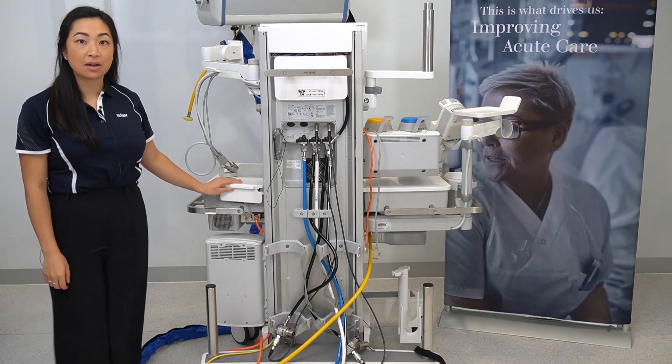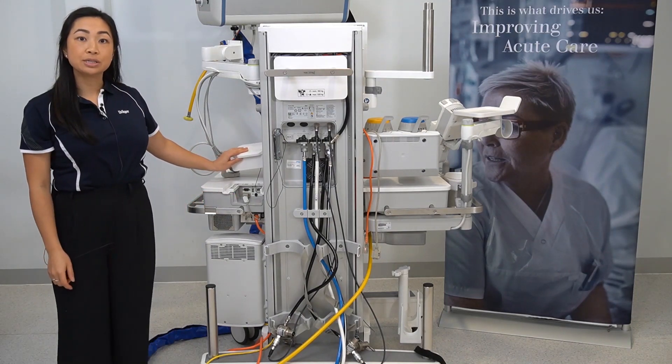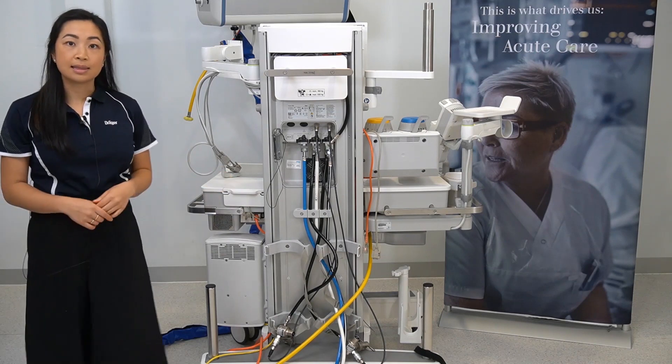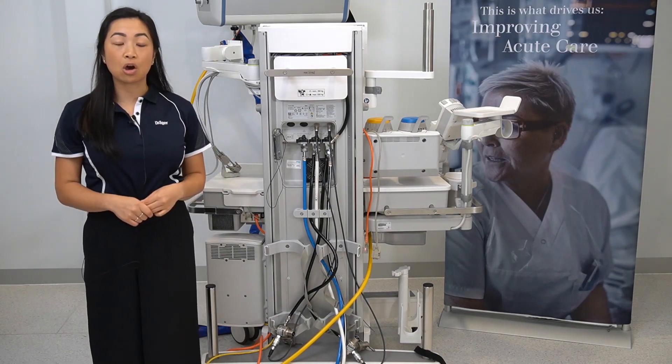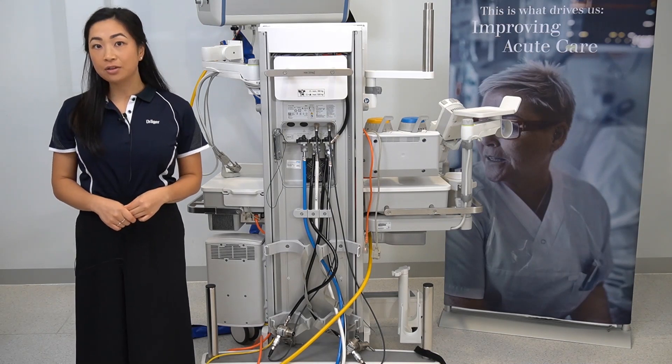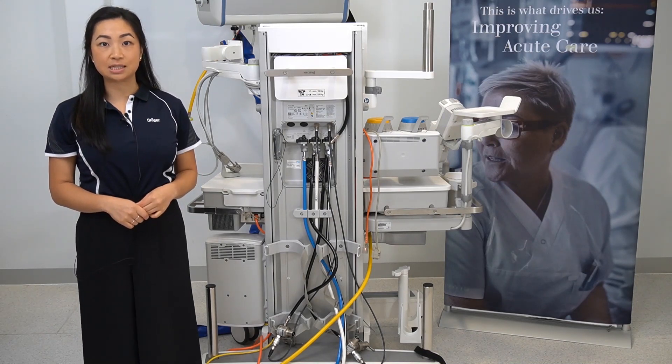Underneath this cover you will find the switch that is used to turn the device off during storage. This will need to be turned on to operate the Perseus A500. For further information, please refer to the instructions for use or contact your local Dräger representative.